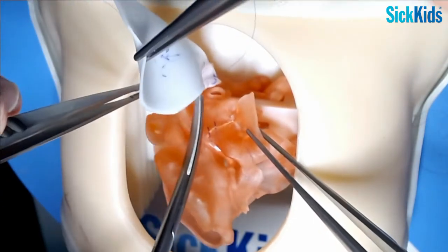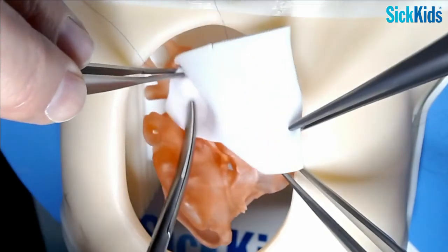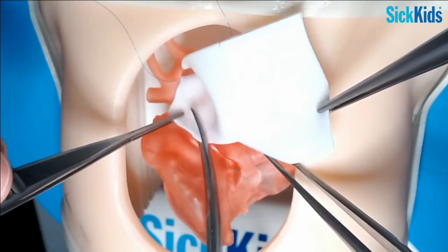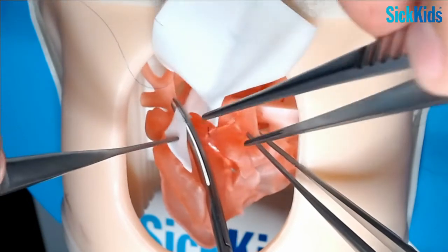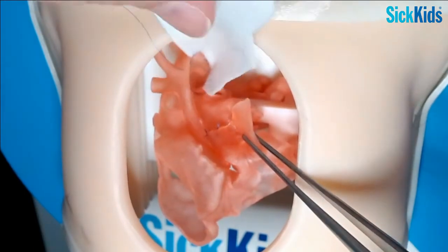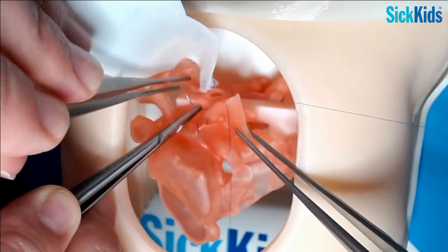So you just kind of hold it in position. And you can see that it's too wide there and that this needs to be cut along here. So we'll make that cut along there to that corner. And that's a key cut to keep it from kinking.